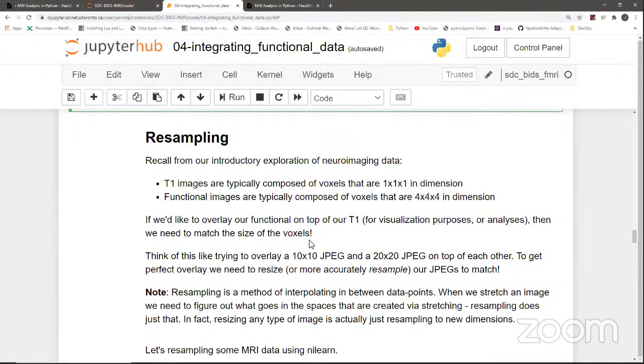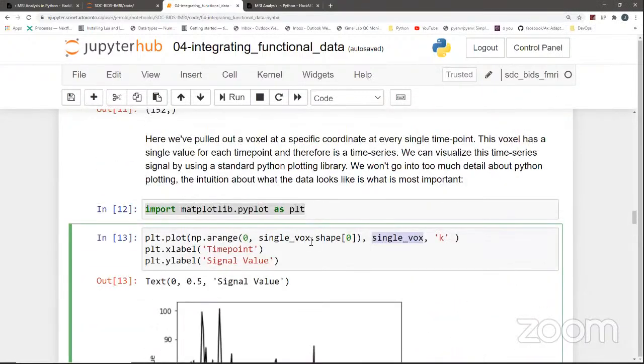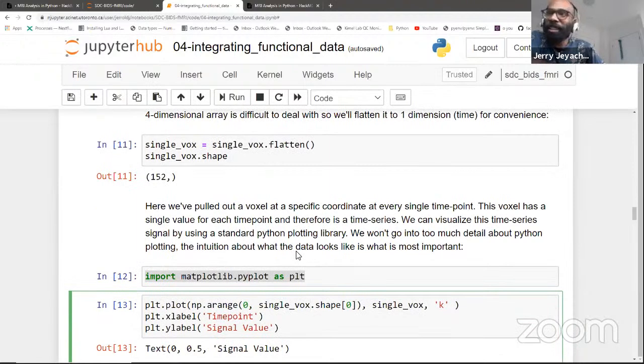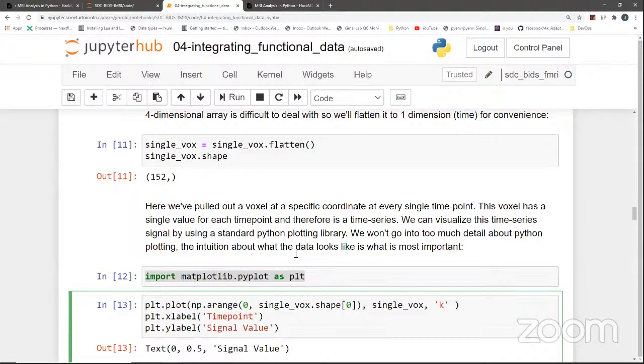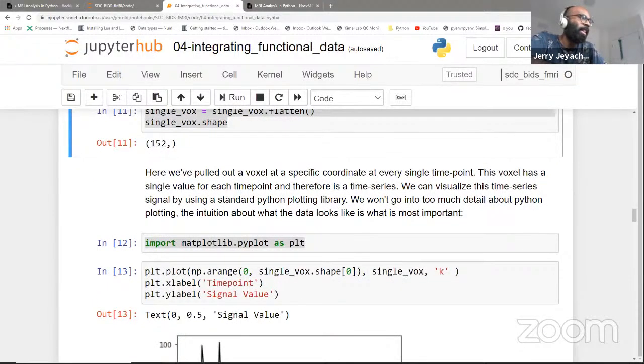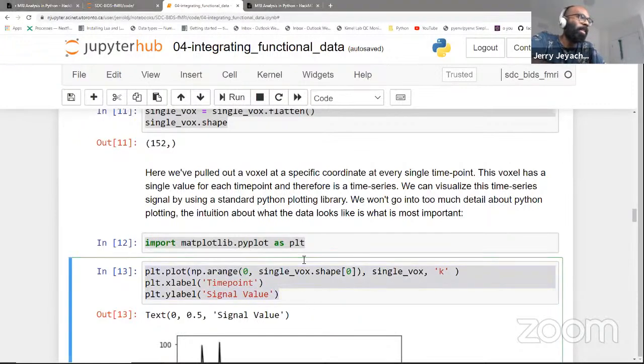Can you just go back to the code? I think she was just asking to see the code. Oh, I'm sorry. So here, does that help? OK. Maybe post in the chat. Yes. Let me just copy paste this into, where's my chat? There you go.